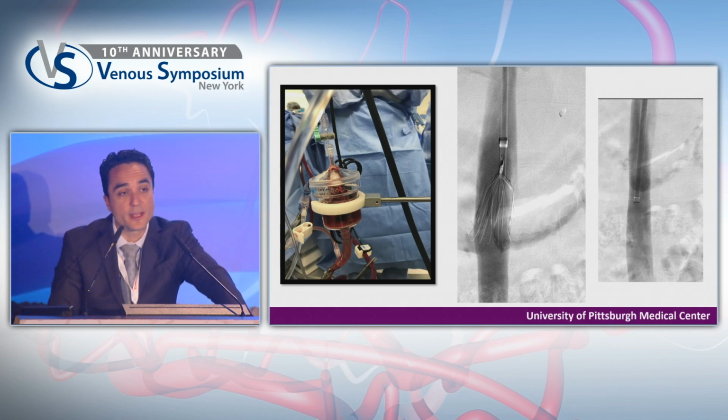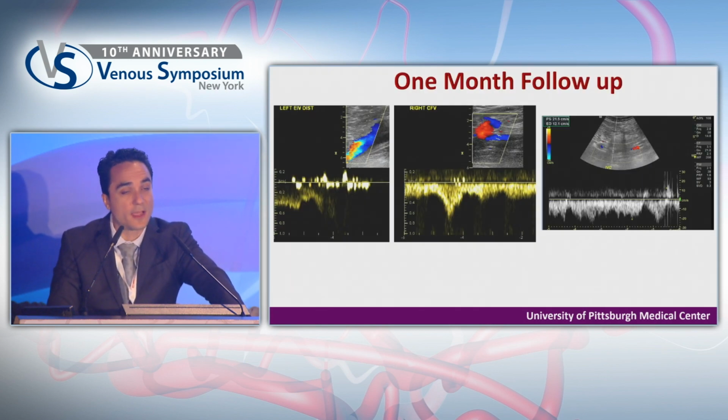The filter was removed a few days later, and it was actually not that difficult. At 1 month follow-up, the IVC is patent.